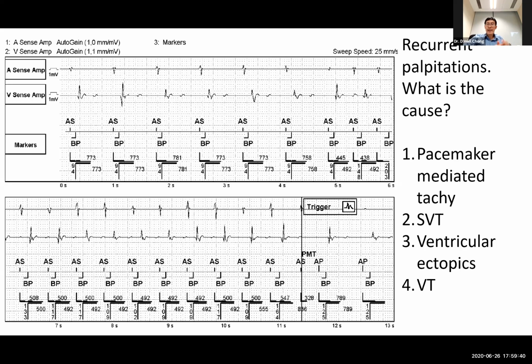So you can put it anterior-posteriorly if you want, or you could put it over the usual places, over the right upper chest and the left lower chest, as long as your pads are about 5 centimeters or more away from the ICD. It would not damage the ICD.